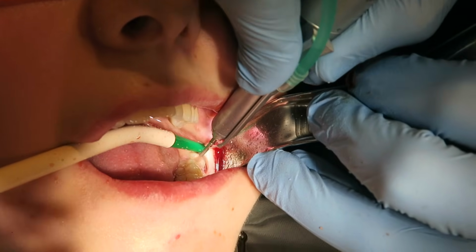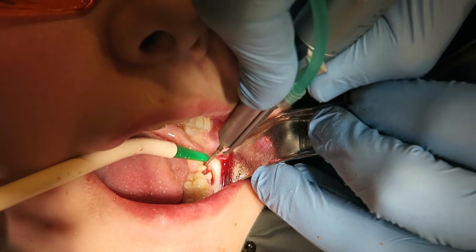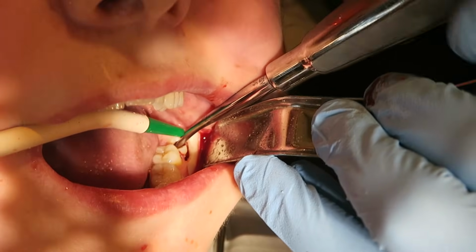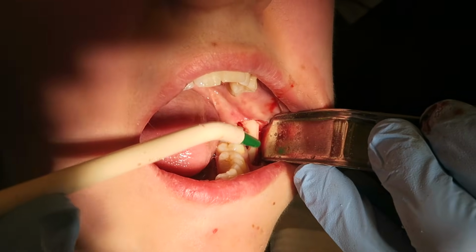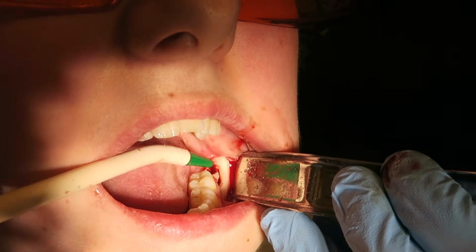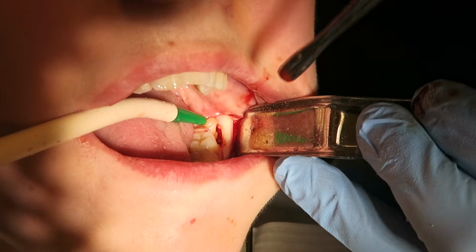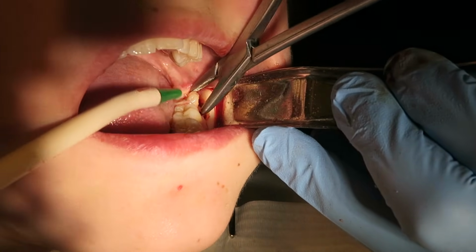So I'm making sure that I cut through all the enamel and dentin to make sure the breaking and splitting of the tooth is less traumatic. Now you can see I'm using the luxator to section the roots. So I've just loosened the distal part, or the distal root, picking it up, and now I'm going to go back and loosen the mesial part of the tooth using the same elevator. If you make a nice cut, then elevation of the tooth should be nice and easy.